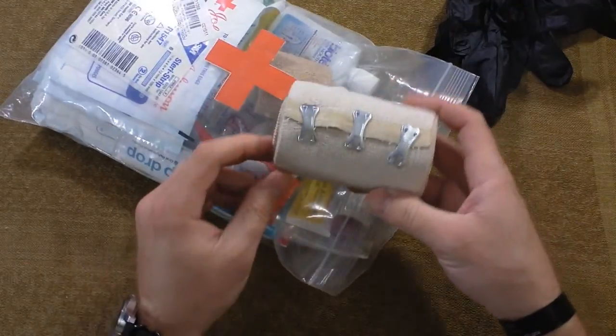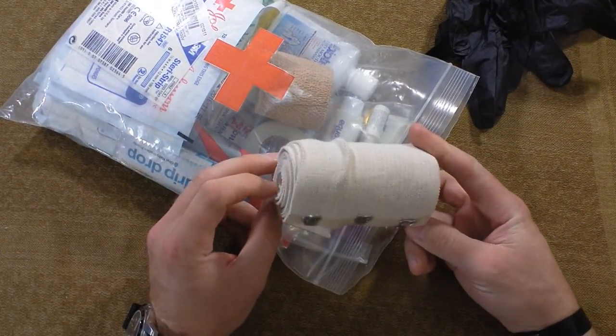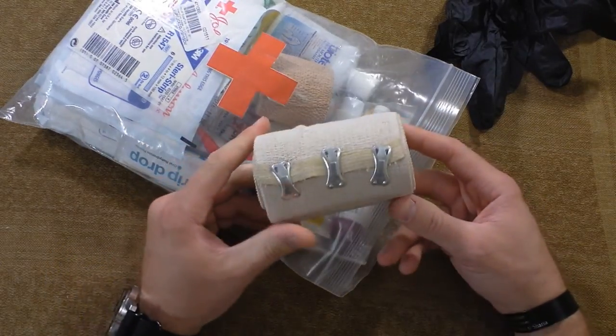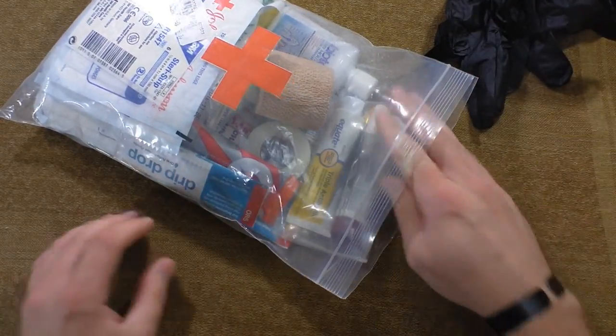I've got an ace bandage here. You always want to have an ace bandage in case you need to wrap something, put a little compression on a joint. You can use this as an ace bandage or as a triangular bandage if you wrap it around right. A lot of uses for that.